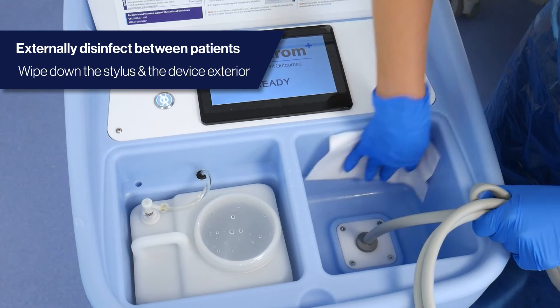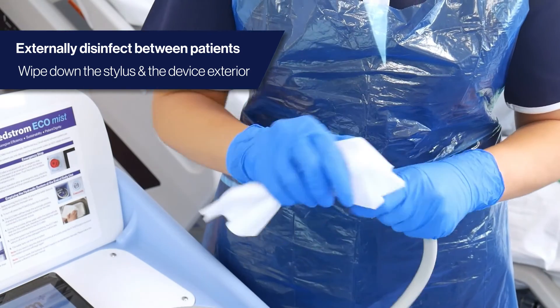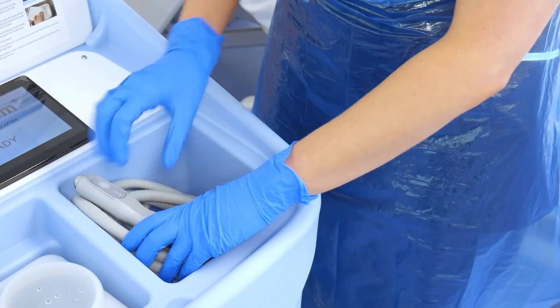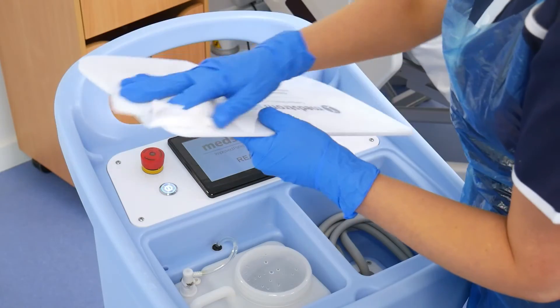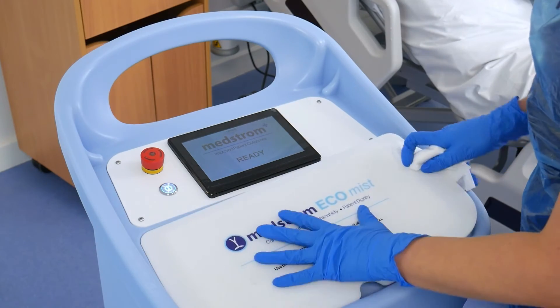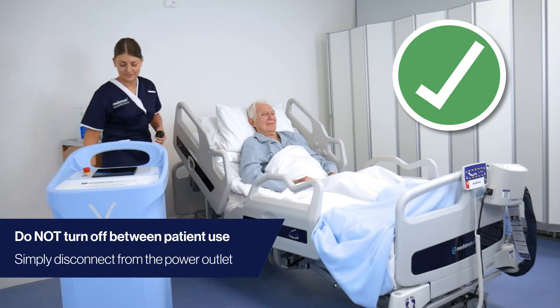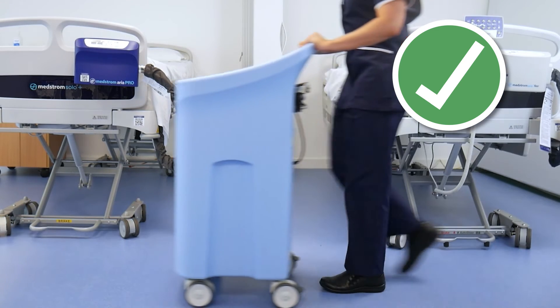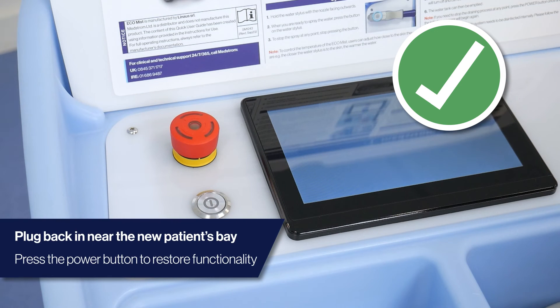When you are finished cleaning a patient, the EcoMist must be externally disinfected by simply wiping the exterior and water stylus with your Trust or Health Board's disinfectant wipe preference. Between patient use, do not initiate shutdown. Simply disconnect from the power outlet, plug back in near the new patient's bay, and press the power button to restore functionality.